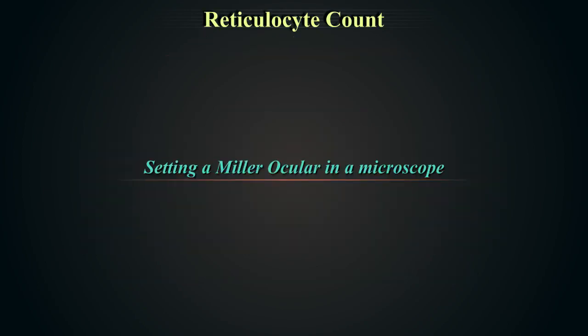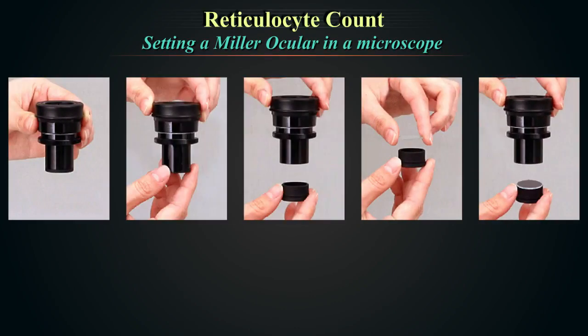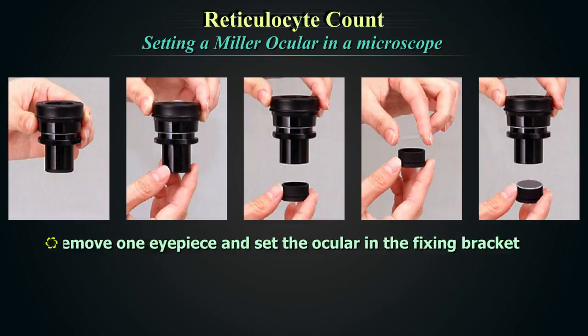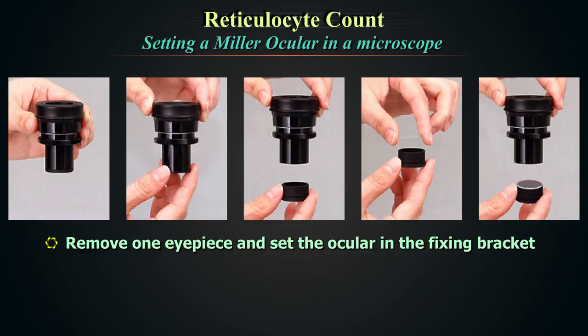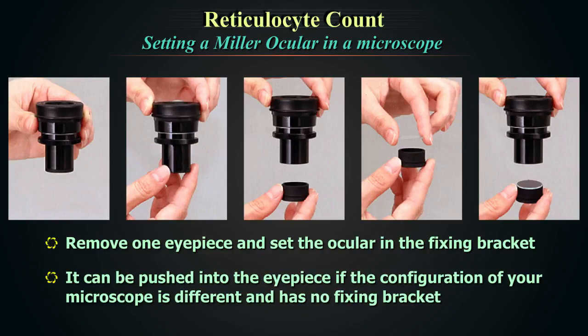To set up a Miller's ocular in a microscope: remove one eyepiece and set the ocular in the fixing bracket. Turn the end of the eyepiece counter-clockwise and remove the fixing bracket for the micrometer. Place the micrometer on the fixing bracket with the printed surface down and insert into the eyepiece. Note that there may be differences between makers and models; you may use just one eyepiece.